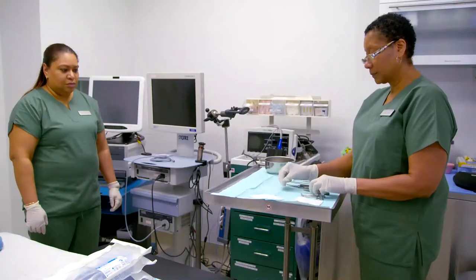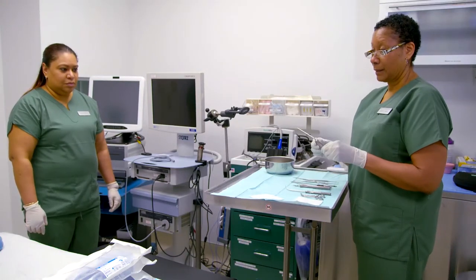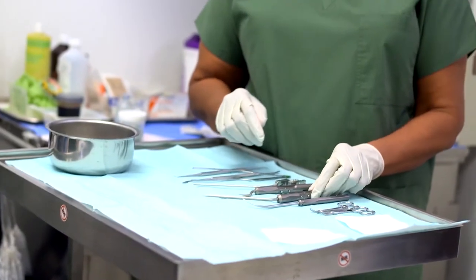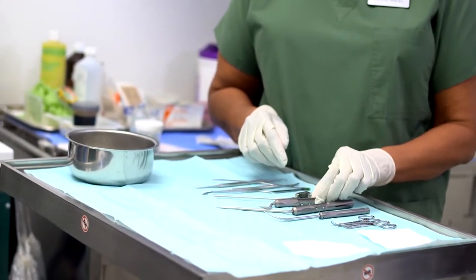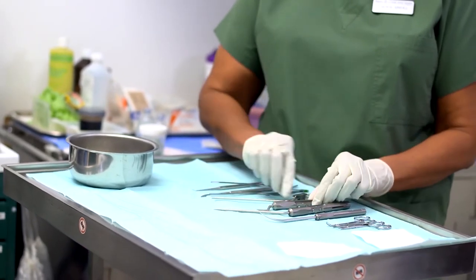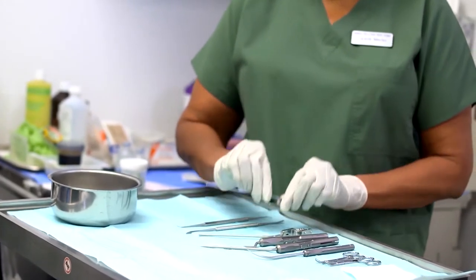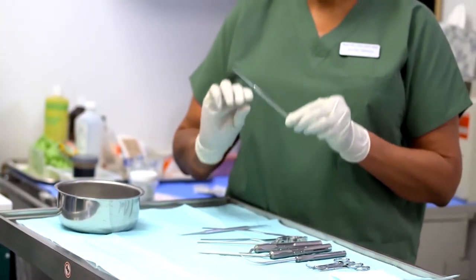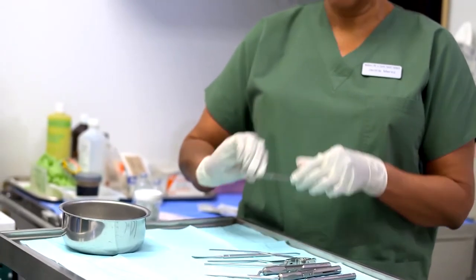So my instruments on the tray would be two towel clamps, Medtronic frontal seeker, sphenoid seeker, registration, suction, bayonet, freer, and maxillary seeker.